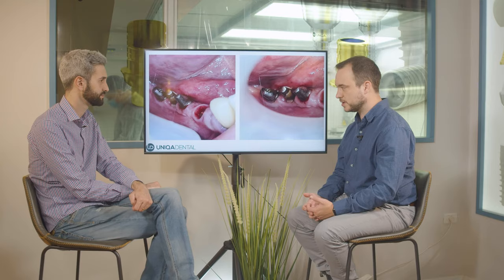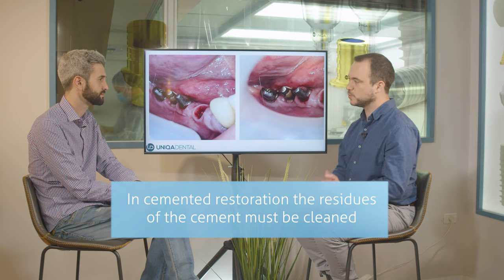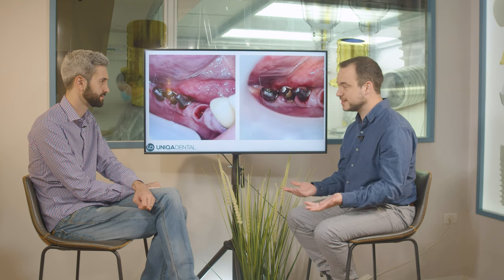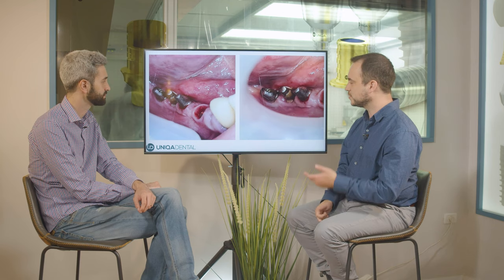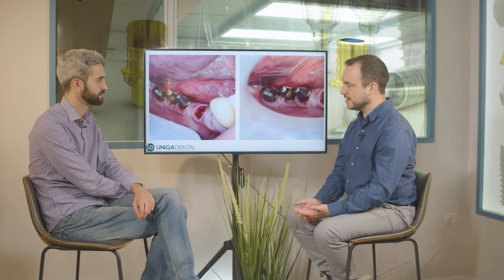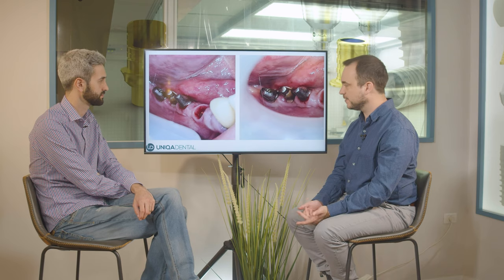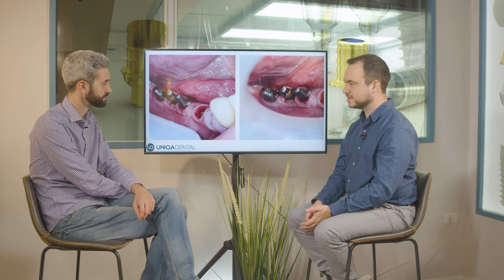That's the biggest issue with cement restorations — you need to clean very, very well and you don't always know if you cleaned well enough. You just don't see it; it's below the gingiva, almost two millimeters below. You don't have any instruments to see it, and even on x-ray you don't see it. So you think everything is good, but later you can have some problems.